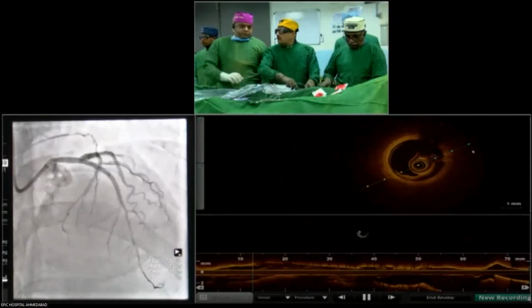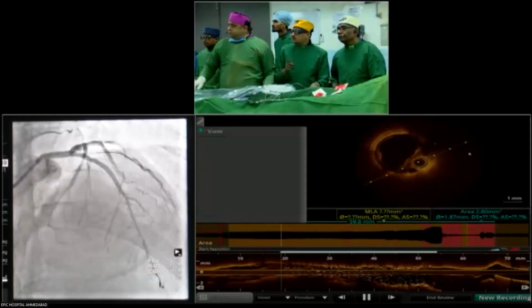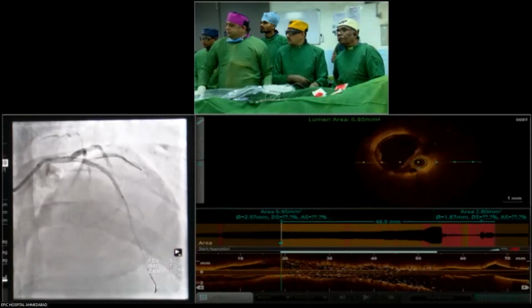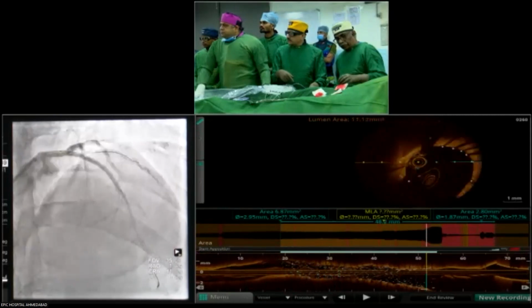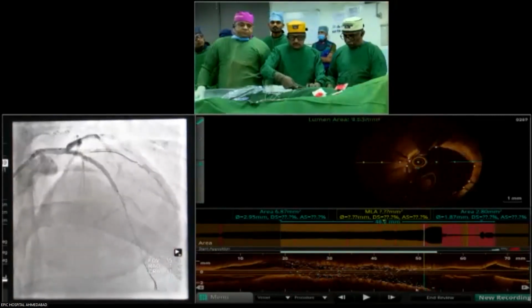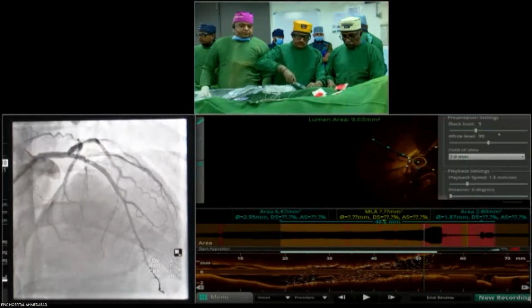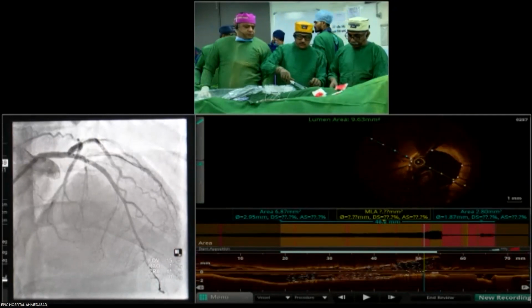Second, which stent was used and what was the gap between the marker and the stent struts? Third, when we took the last angiographic view after deployment of the stent and the POT was being done, I could find some geographical miss in the ostial part.